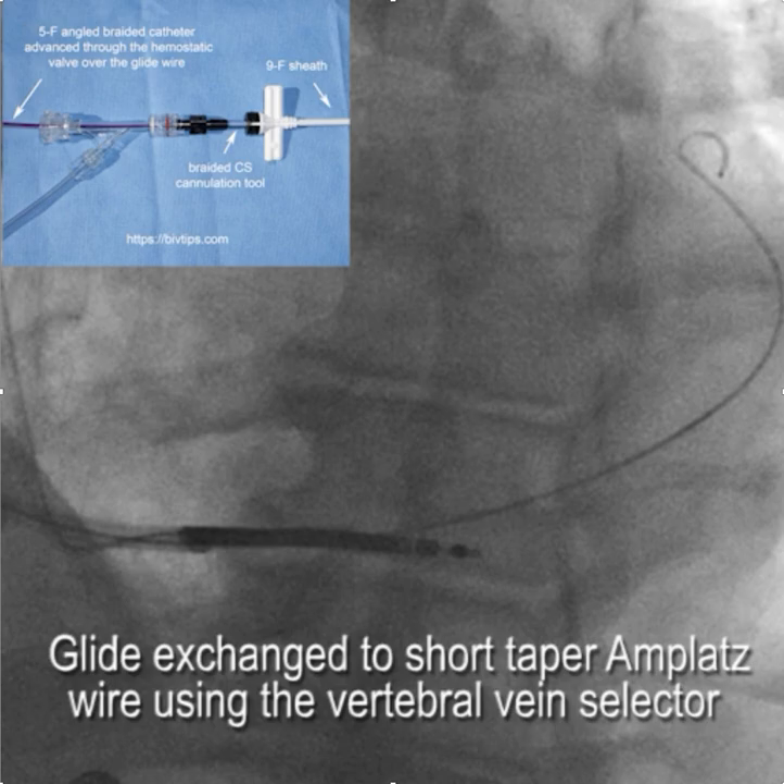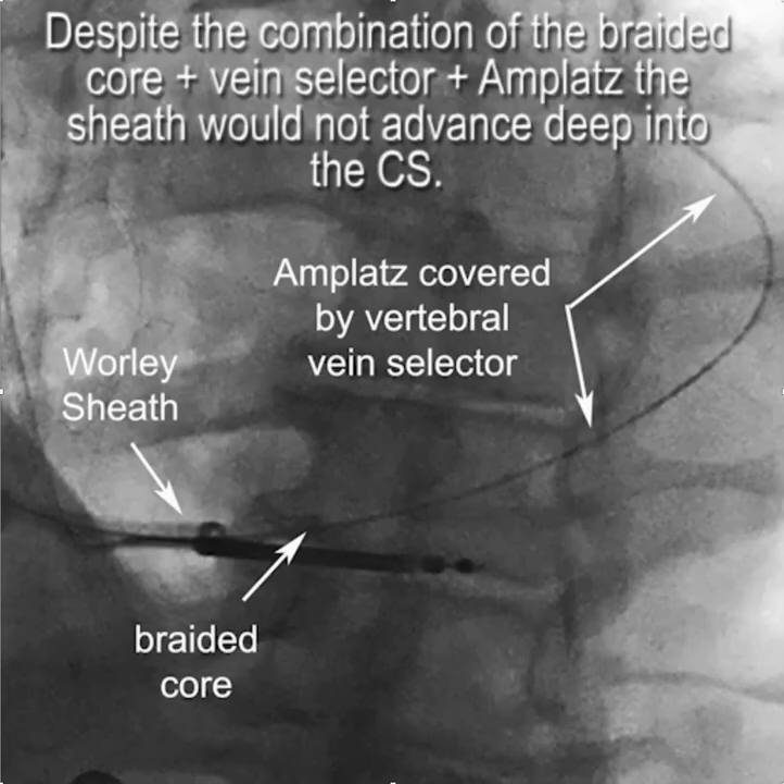We got to this point, and usually this provides enough support to advance into the coronary sinus. But despite the combination of the braided core, the vein selector, and the amplatz wire, the sheath just would not go any further. Given that we had seen a lateral wall branch right out here, we decided to park the Worley sheath just at the ostium of the coronary sinus and maintain support with the amplatz wire.